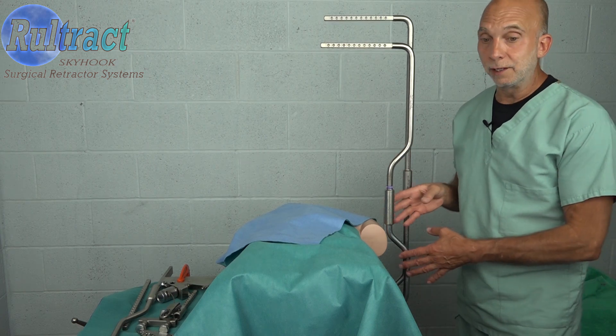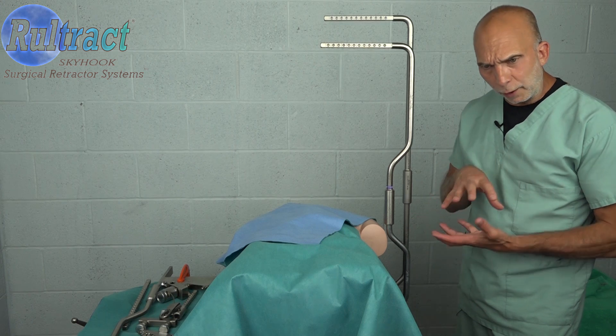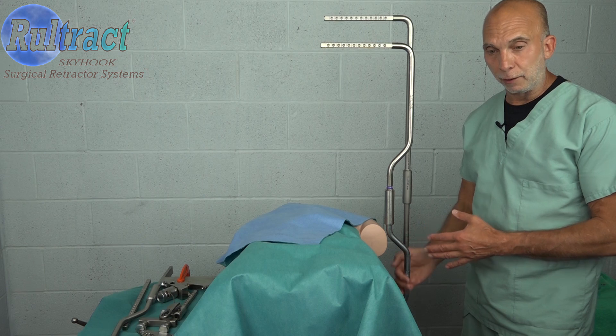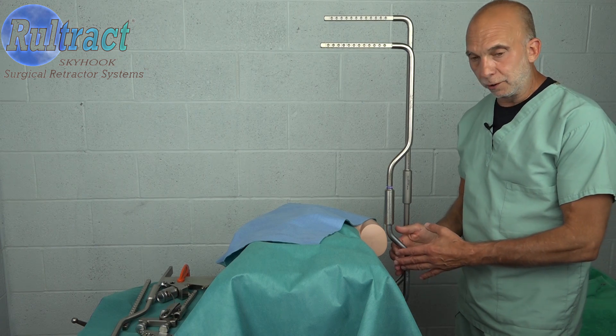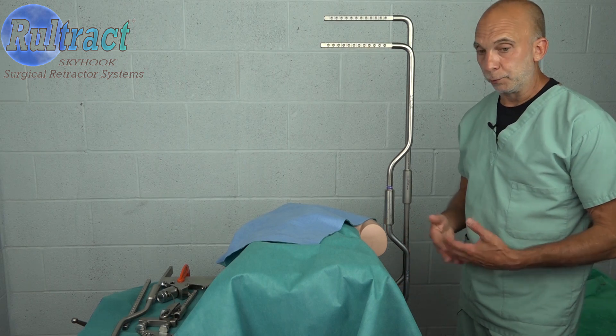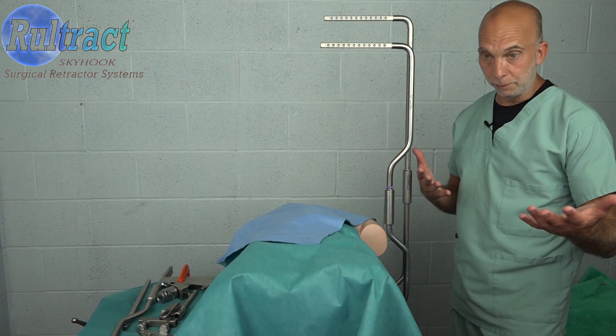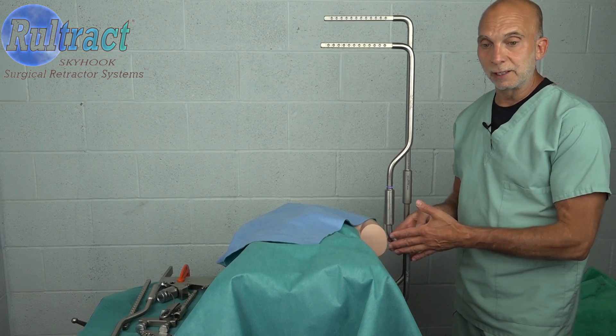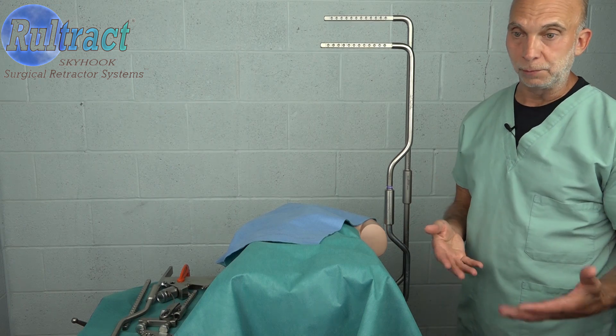Many years ago when this was designed, mattress pads were not quite as thick, patients weren't quite as large, and this area here was actually very efficient in providing additional space for the patient's shoulder and arm. Through the years as the patients got larger and the mattress pads got taller, this moved up. So now it's not quite as effective if it's set up how it's supposed to be.